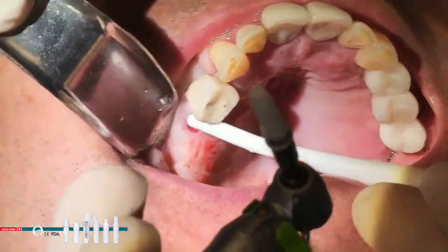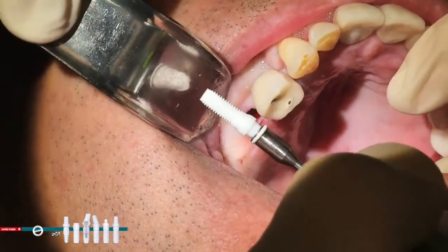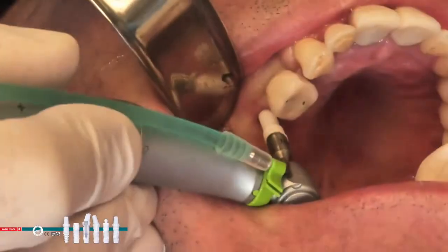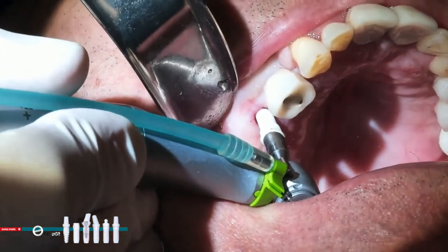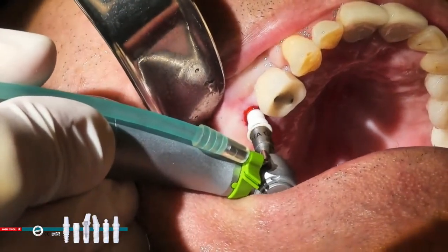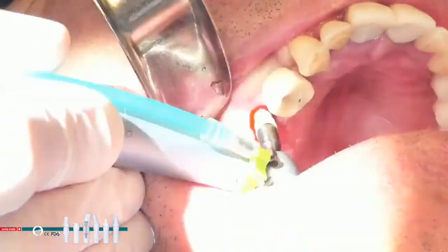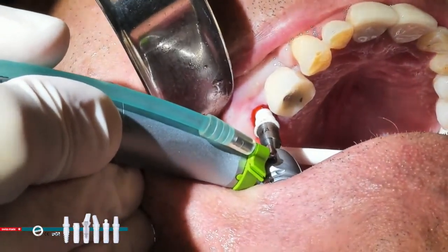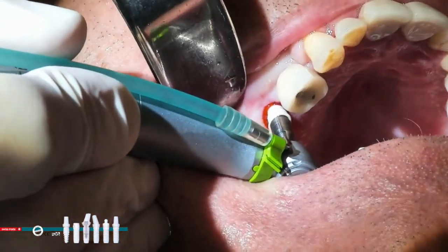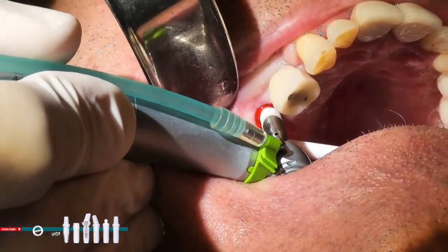And turn away a little bit. And you just very carefully and slowly open wide. You place the implant into the osteotomy right there. And then you start the motor. And you make sure your angle is okay. And you can see the blood streaming through the threads. That shows that this implant is hydrophilic. And the tissue, the blood, the body loves it. So it goes right up these threads. And it will give you a very nice integration.